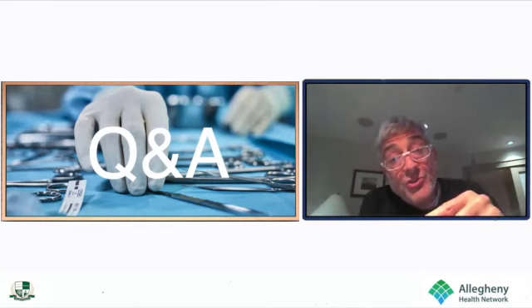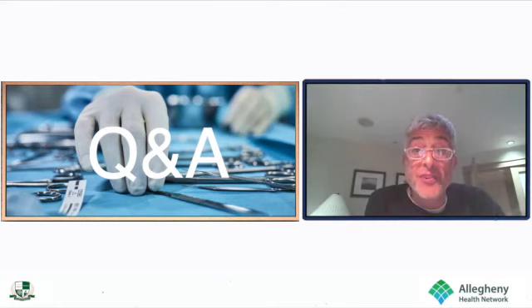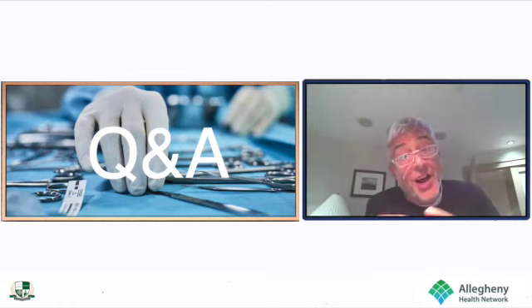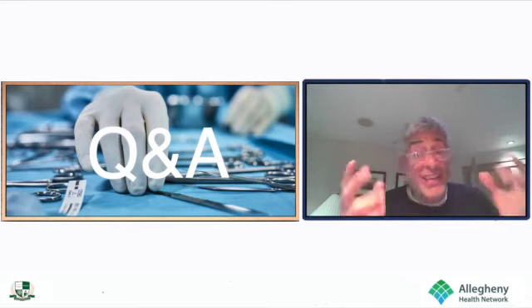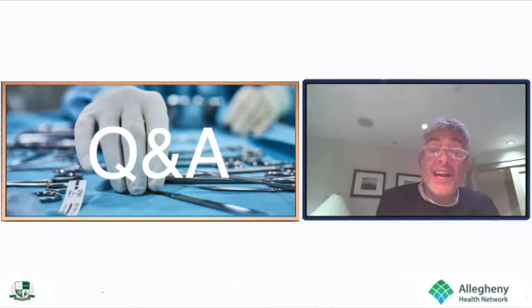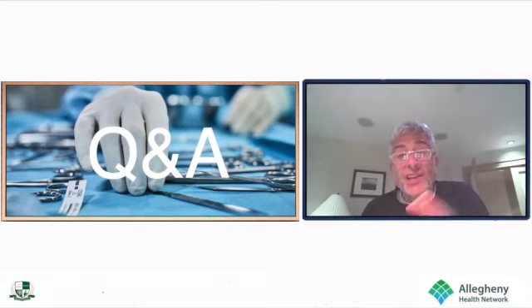Now, virtual reality, I believe, is going to be the right application for that. Why put four pedicle screws in and two rods in and cut down when you can just pin the facet joints if you've got something in front and you know the biomechanics of facet screw fixation? There, you put the headset on and in 15 minutes, you're done. That makes sense. And that's the beauty of spine surgery. We've got all this technology. We just have to figure out for what I'm going to do today, what's the right technology to pull off the shelf.